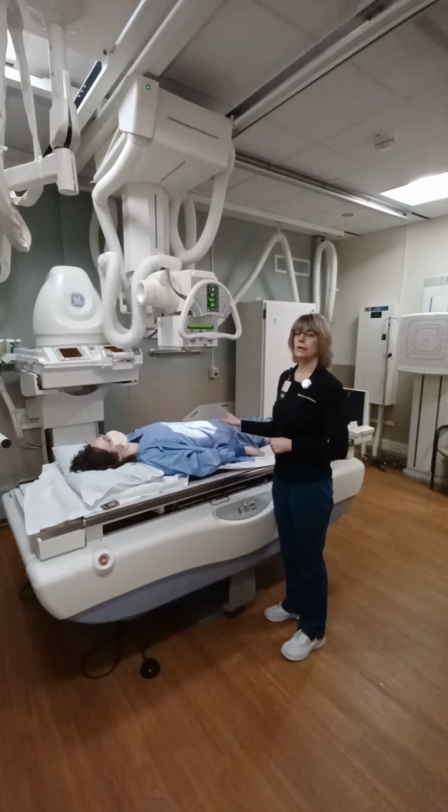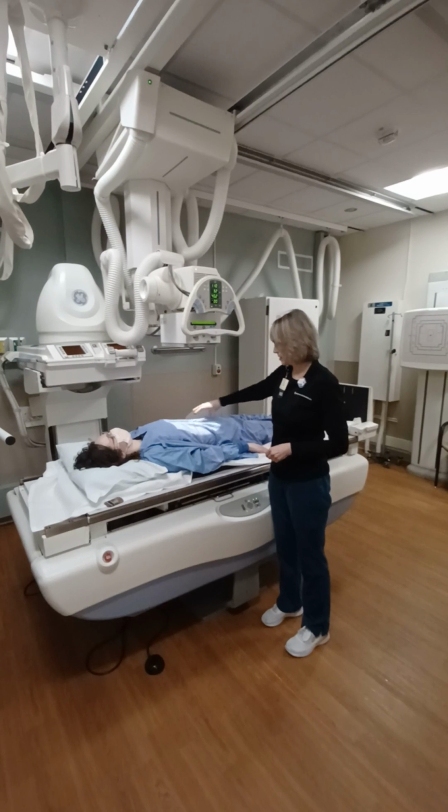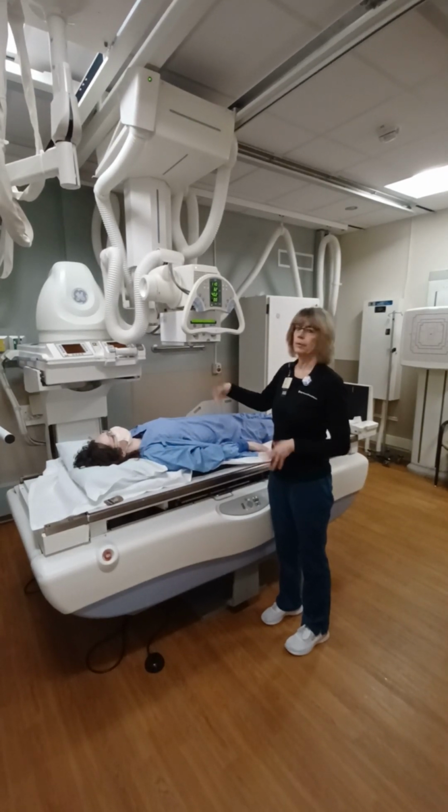All images should be done on expiration so that the diaphragm stays up and leaves the stomach lying in its natural shape and position.